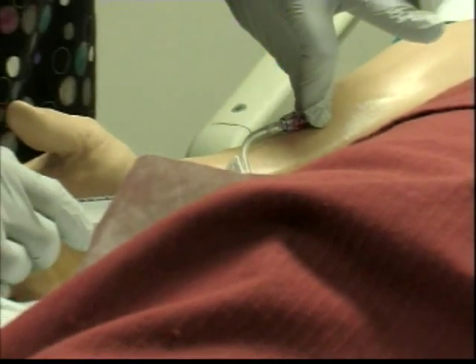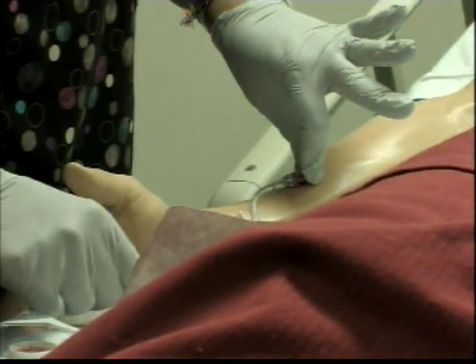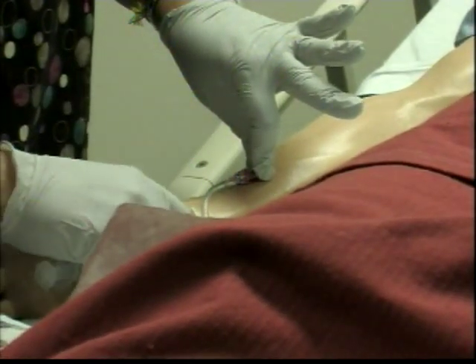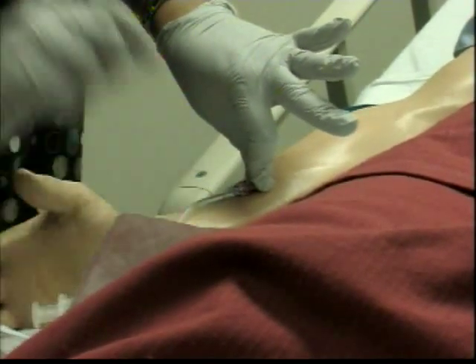Pay attention to my fingers. I'm not touching the site at any time. I give it the flush. I put the needle back into the cap so I can put it in the sharps container, and it's covered and at low risk of giving me any puncture. So I just want to make sure that I remove this with my hand, okay?